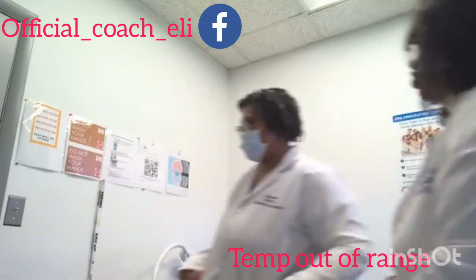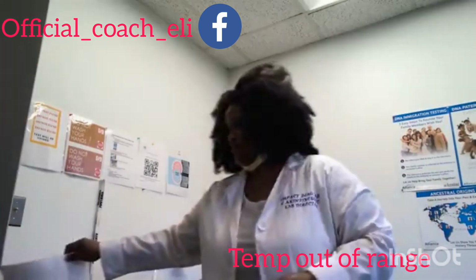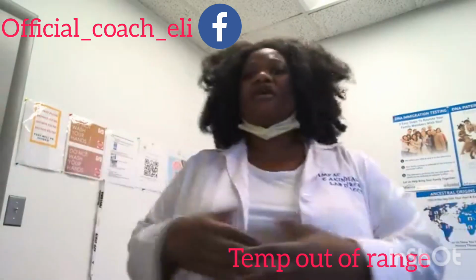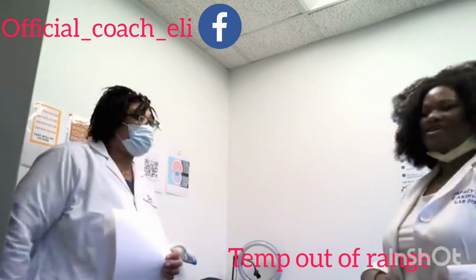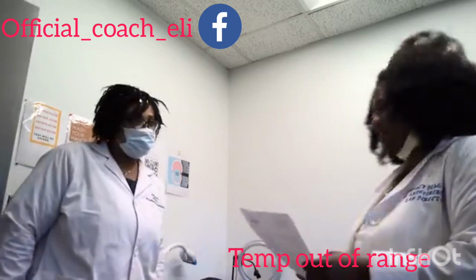So Ashanti, why don't you go out there. As normal, you would continue with your day-to-day operation, and you would just see some people walking or whatever. We anticipate receiving a donor. Hello. Hi. My name is Ashanti. I'm here to get the test done. For a drug test? Yeah. Can I see your authorization form and your ID, please?